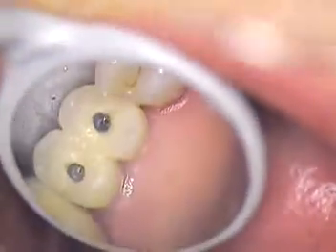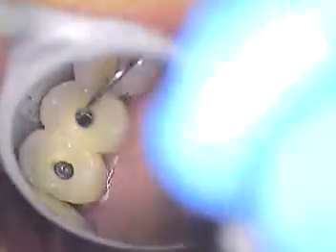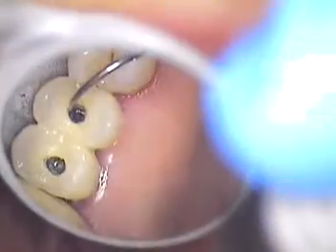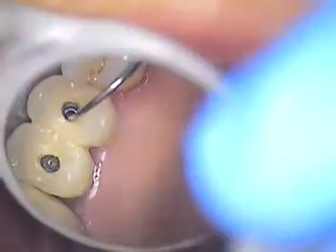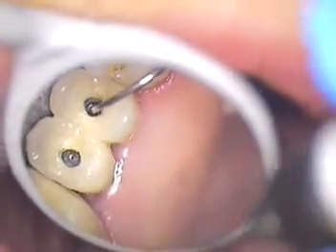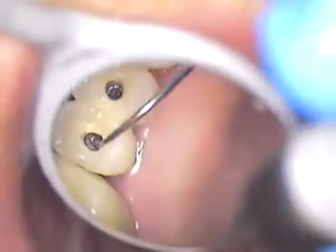Number 13 looks like a housing that spins internally and is very, very hollow. Let me just demonstrate. There's a hollowness to it, but here it does spin. Whether it's just the housing that's spinning or the screw itself, we don't know.